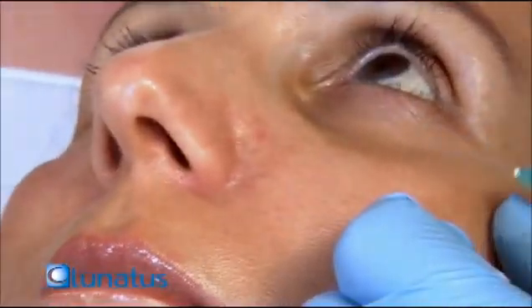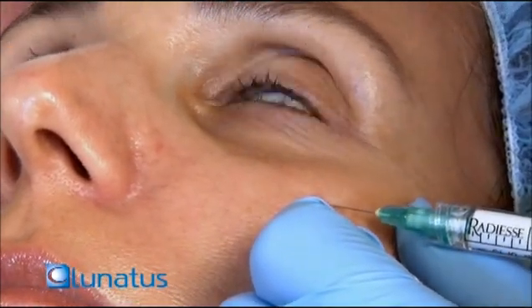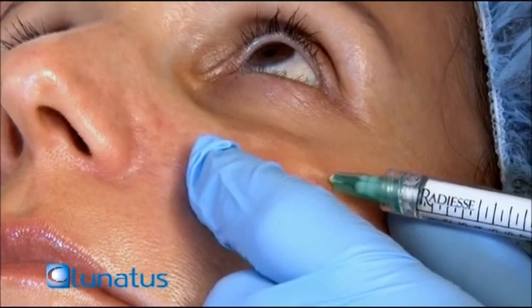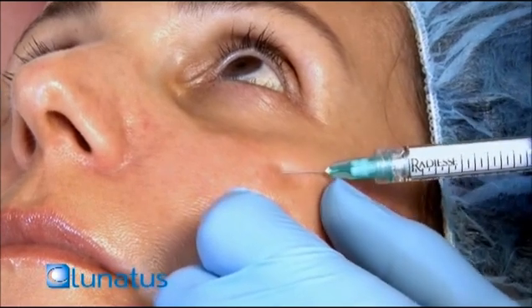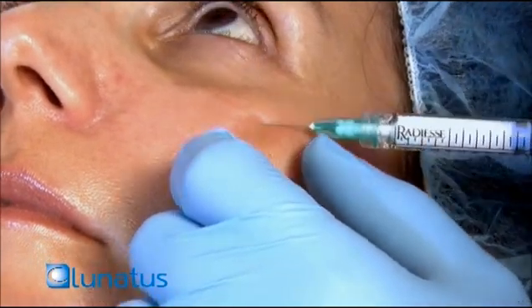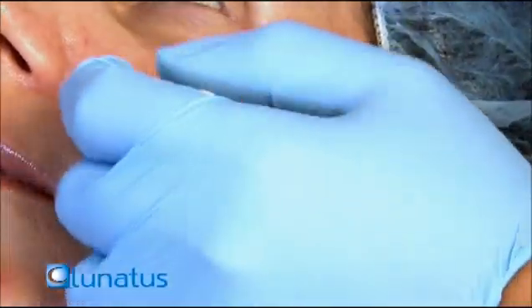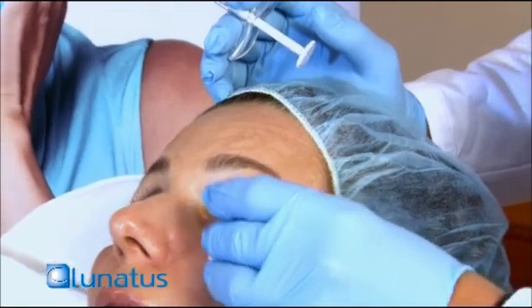I see the defect right over there. So I'm going to try to trace where the defect is, and I'm going to be injecting the material right there. Same thing, I like doing the anterograde. Put a little bit of anterograde, and come out, and fan it slowly. Come out. Very good. Okay, so massage, massage, massage. Massage is very, very key here.